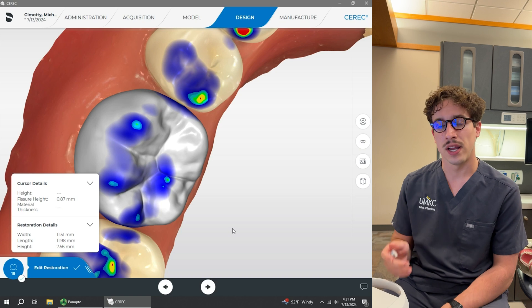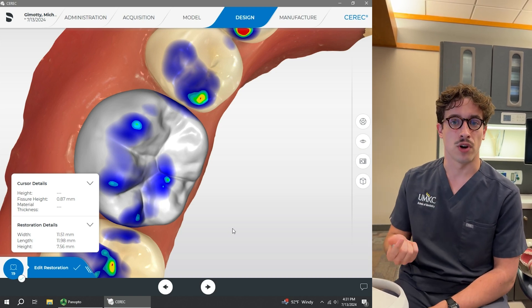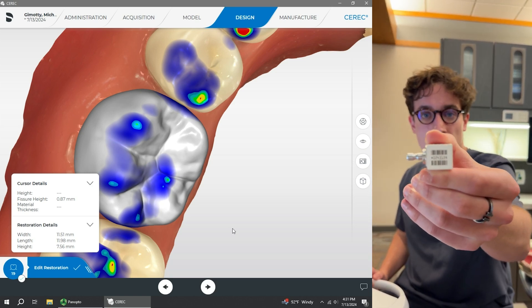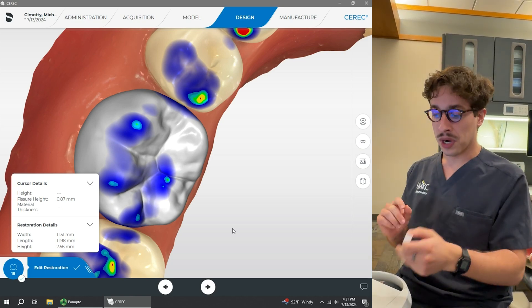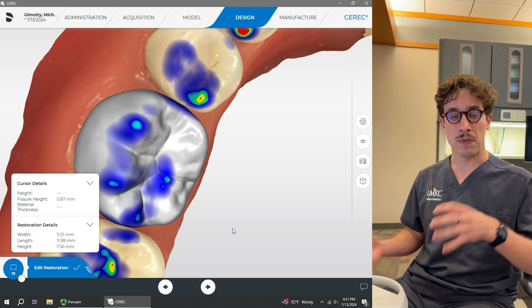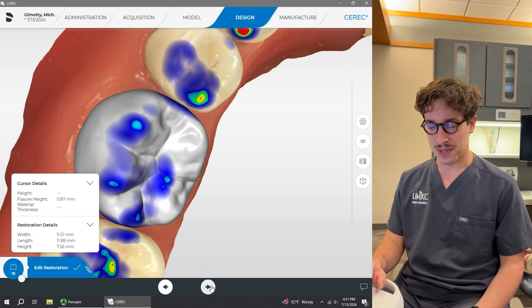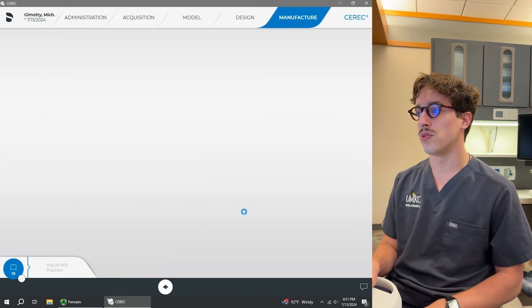Now that our design has been finished and we've shown it to our faculty and they've approved it, we're ready to move on to the milling process. We're going to get our block — all those zirconia blocks have a barcode on them along with numbers. We're going to have to enter that into our software so that it communicates with the milling unit to ensure it's milled correctly. We'll move on from the design tool by hitting next, which will bring up the manufacturing page.